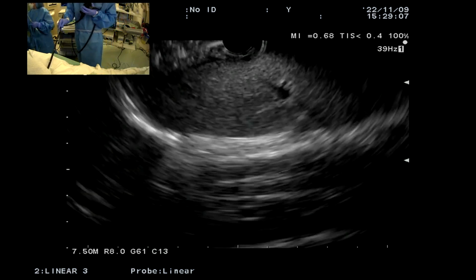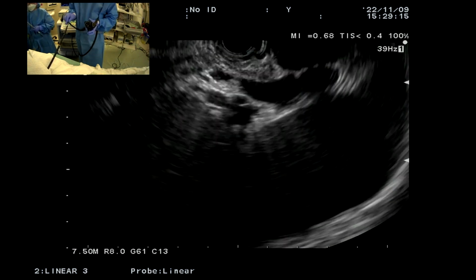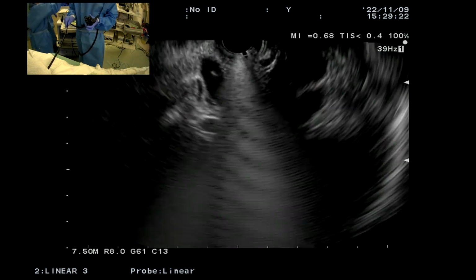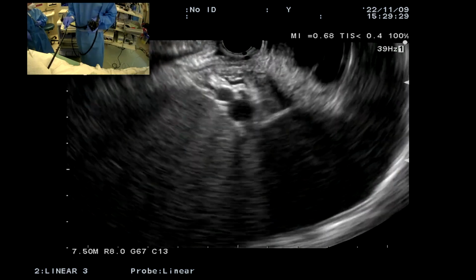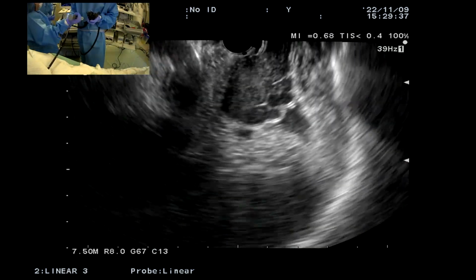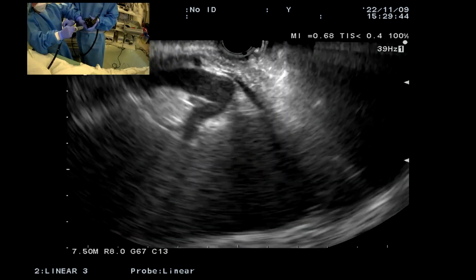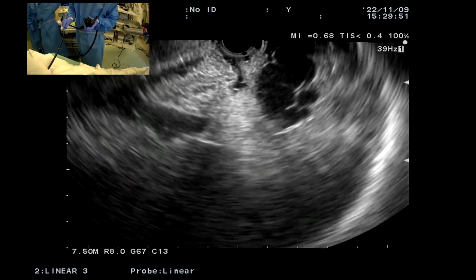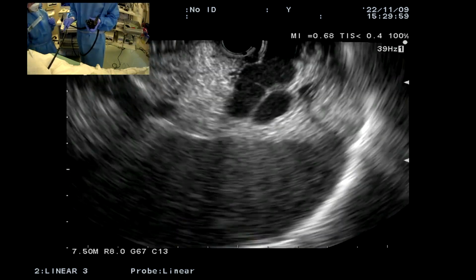And now we'll just pull up towards the fundus, and I'm going to turn the scope in towards the fundus, and we will now start to give some water into the lumen. So can I have some water, please, to fill the fundus? And this will help define the fundic varices a little bit better. And we want to start with low mag to see if we can visualize gastrorenal shunt. These patients nearly always have large gastrorenal shunts. You can see some of the blood flow in, yes please, these large fundic varices. And you can see it's perhaps one large varix, but it's all coiled up.